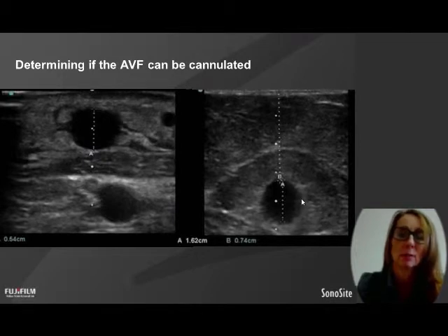I get a little bit of blood bleeding up into my needle, and I get those clots that we talk about where we think that the vessel's clotted, but actually we've just cut a hole in the side, put a little bit of blood in, and it's clotted the needle. So having an ultrasound to keep my needle tip on track the whole way down, keep my angle right, I'll be able to get into those deeper ones.